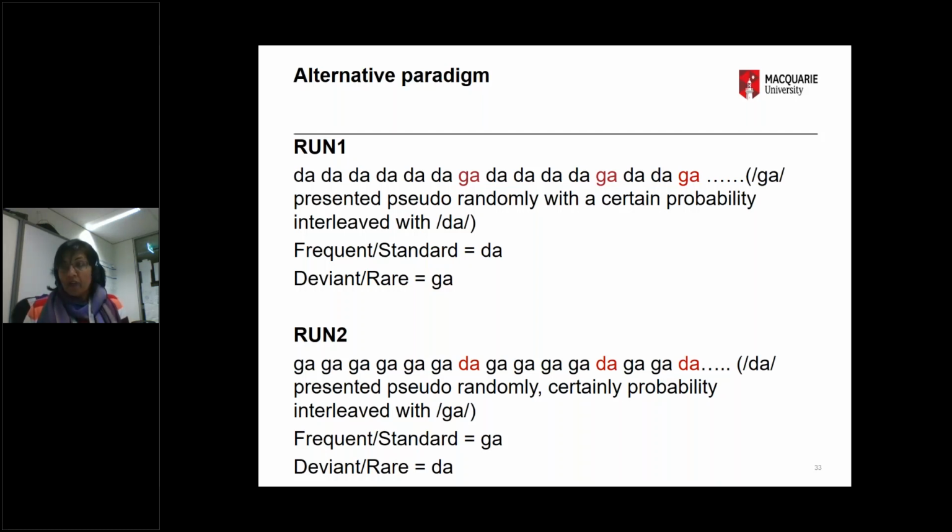Some studies have shown that actually, for instance, if you have your standard as high intense stimulus and your deviant is low intense stimulus, the P300 is not as big as when your deviant is higher intensity. So there seems to be some sort of possibly adaptation or habituation that plays a role, but it's not very well understood. But nevertheless, I did say two advantages. The first is about being able to check the discrimination in both directions.